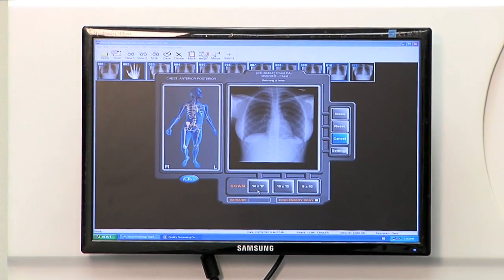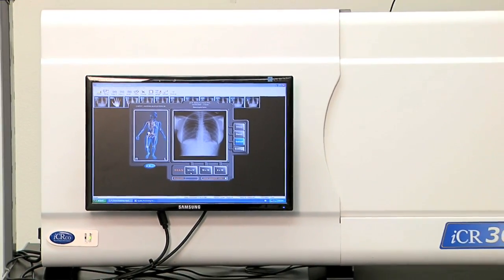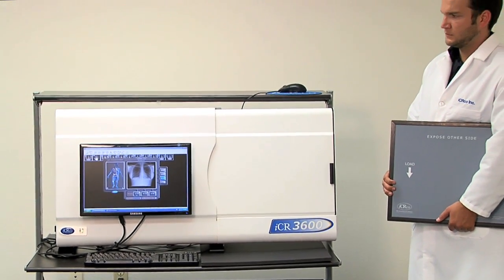Your preview image appears in only 25 seconds. Once the image is acquired, you can further manipulate images to the physician's preferences. Xscan also offers superior functionality and ease of use.